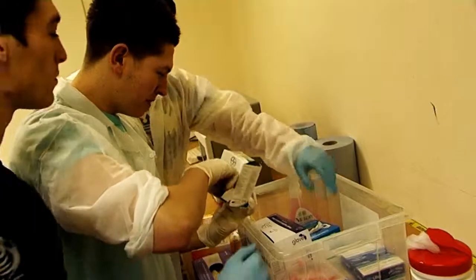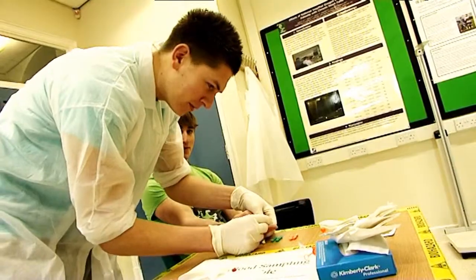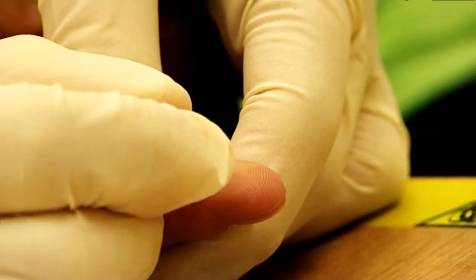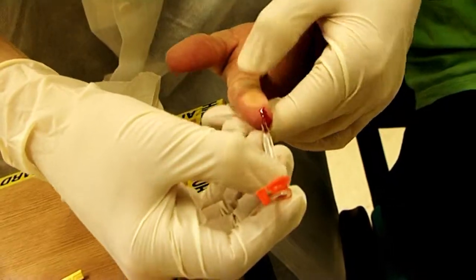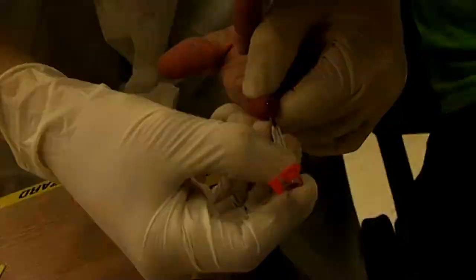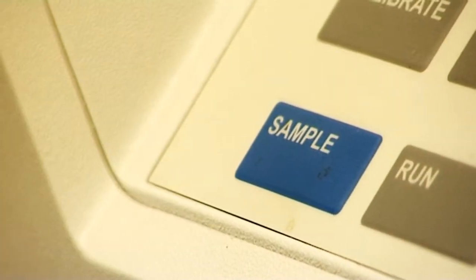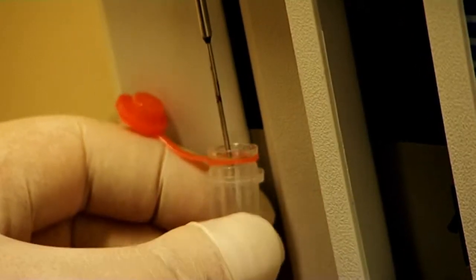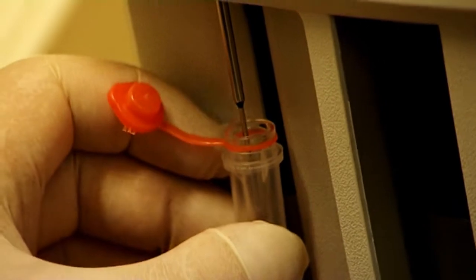So what the students have been doing for the past few weeks is learning how to take fingertip blood samples and analyse them in terms of blood glucose and blood lactate. We've done blood sampling over there, taking the blood samples from the participants, and then we bring the blood sample to the analysis bench and press the sample button here, and the needle will come down and open the tube up and submerge the needle into the tube, and this will take a blood sample.